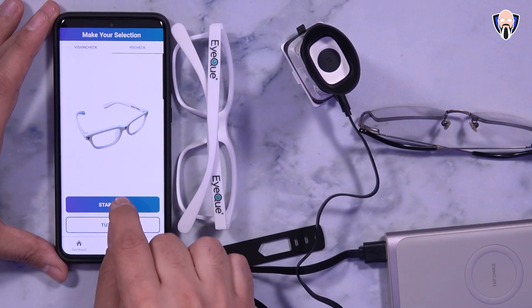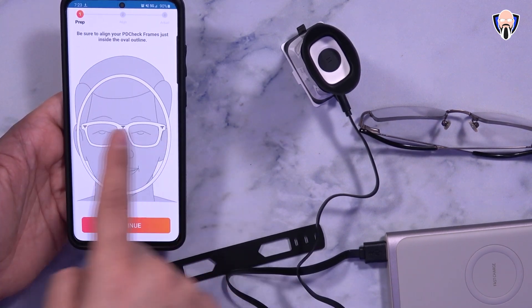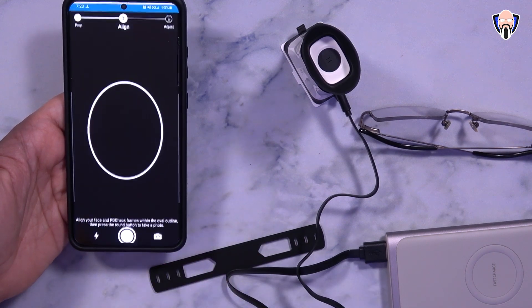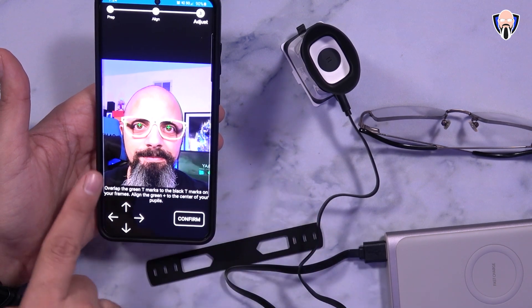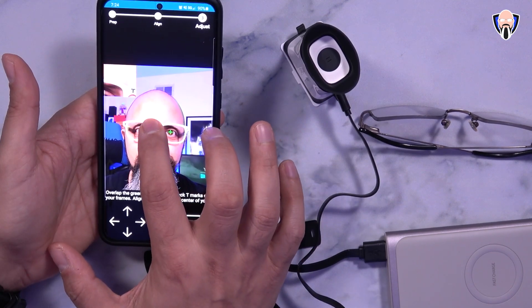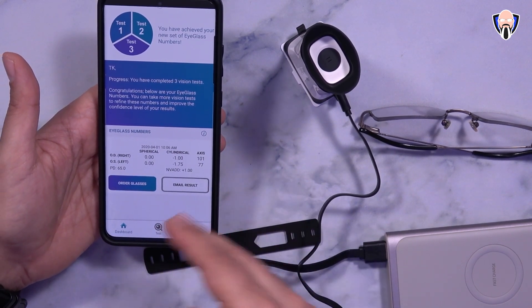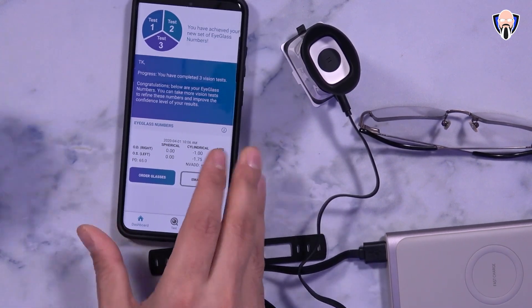Now the second test is basically the PD test. We're going to go ahead and say start now — we're going to actually wear these glasses. You want to be able to align the image exactly to what it looks like. The frame will be set on the display and you just basically adjust the distance of the device to get the best experience. As you can see right there, it actually did snap the image. What we're going to do is align the different levels — you notice the T's are not actually sitting in the right spot. The goal essentially is just to get everything set up in the right format so that it knows exactly where things are. Once we have this information, we can use it to actually order prescription glasses directly from websites — again, the example would be Zenni.